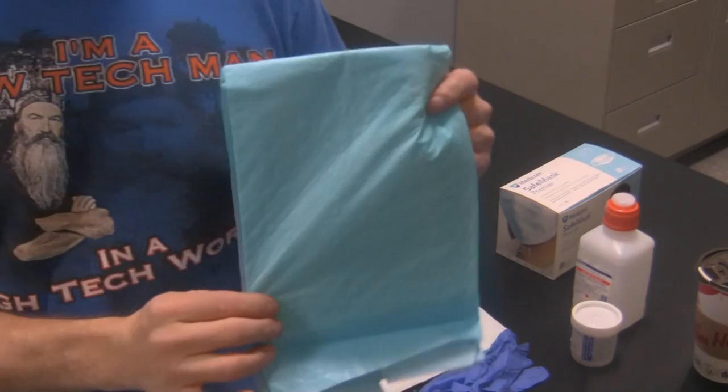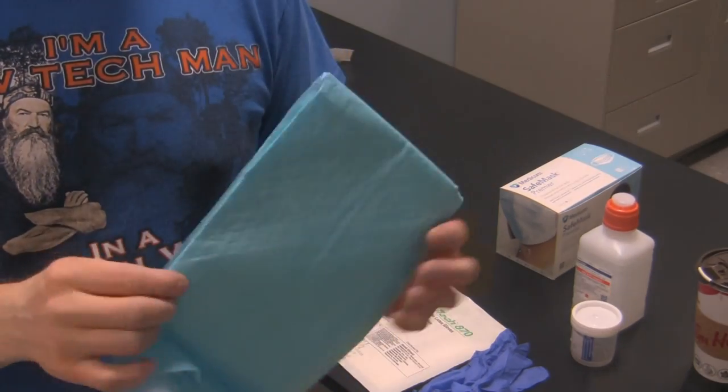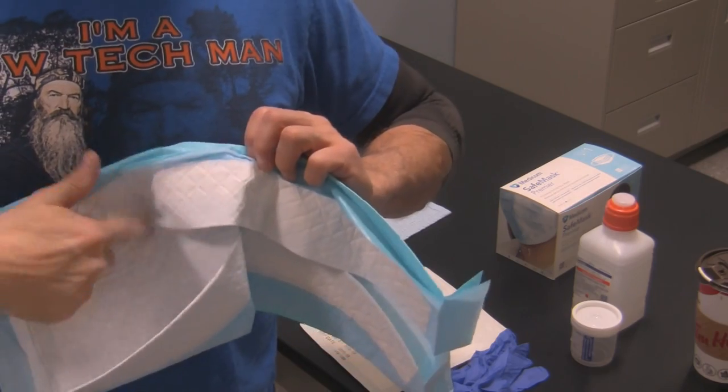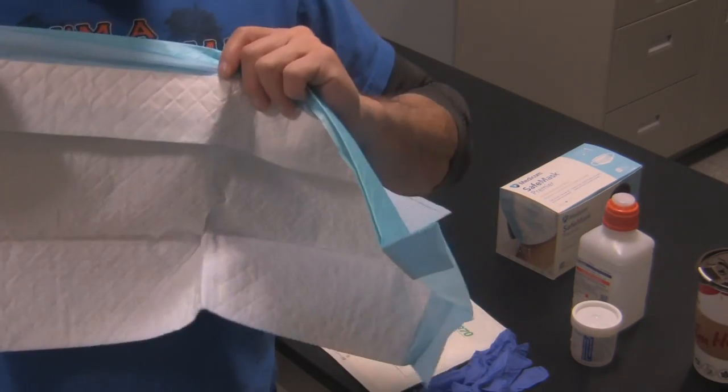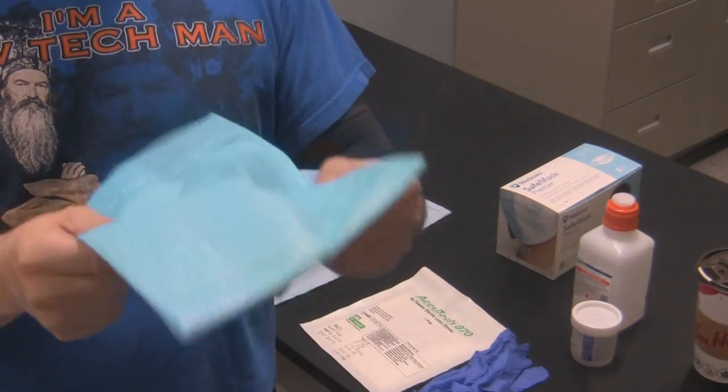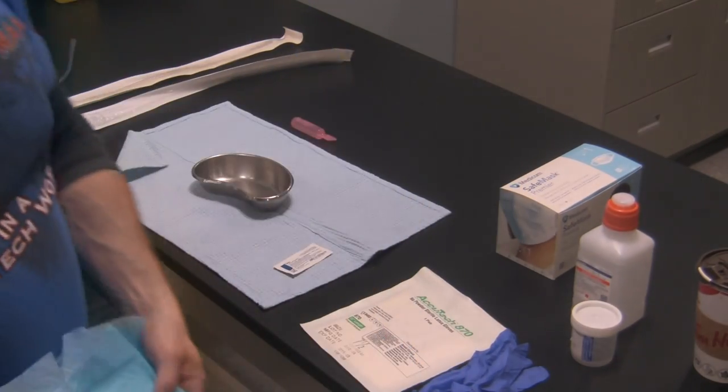You'll also need a blue pad to put over top of the patient's chest. Remember to always have the absorbent side out, because if there are any secretions that come out of the patient and they fly onto the patient's chest, you want them to be absorbed by the blue pad.